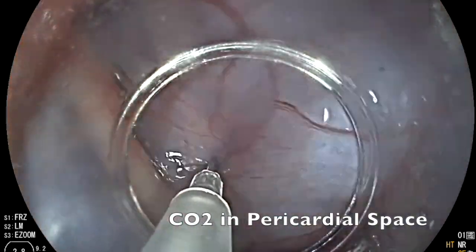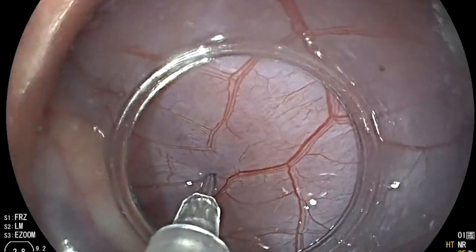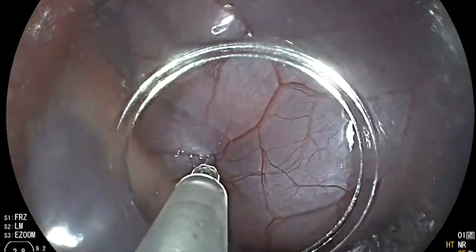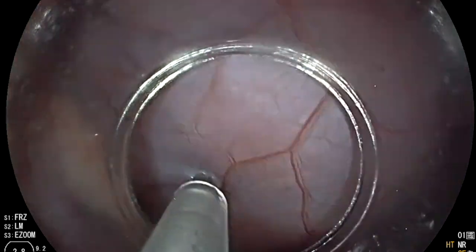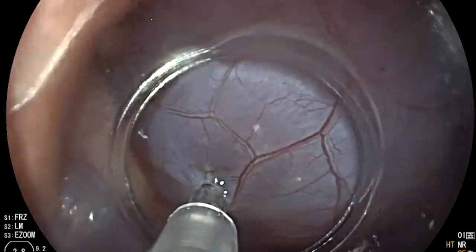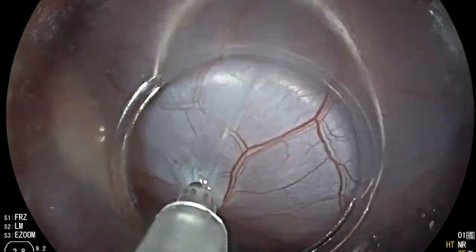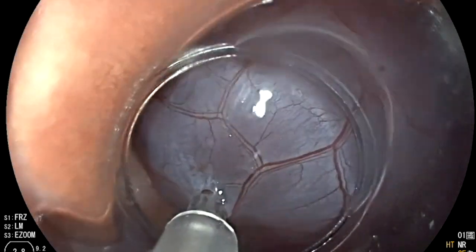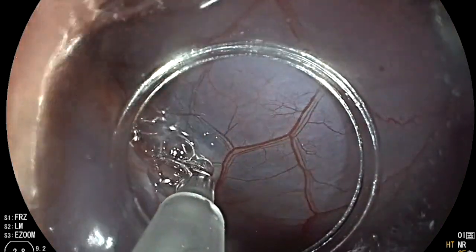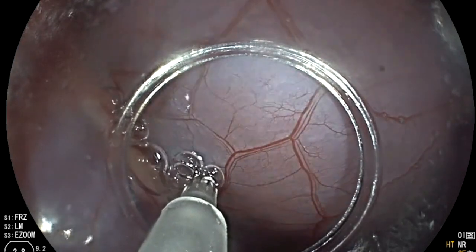We then use an Interject needle to carefully access the pericardial space and inject it with contrast. You can see transient tachyarrhythmias were encountered during access, but these arrhythmias quickly resolved without any treatment. We then insufflate the pericardium with CO2, and you can see the pericardium lift off of the heart with fluoroscopy.